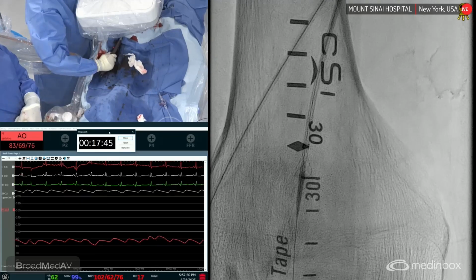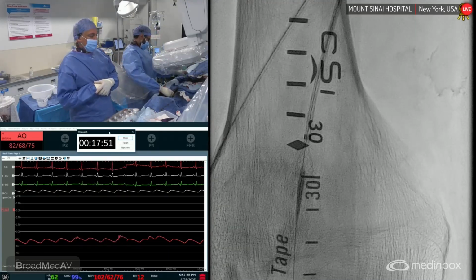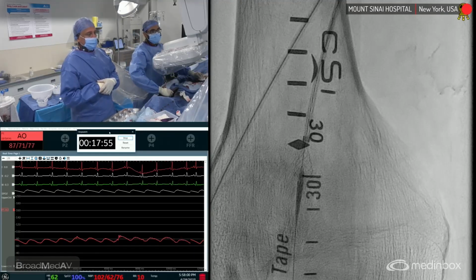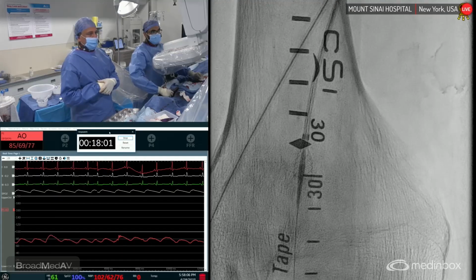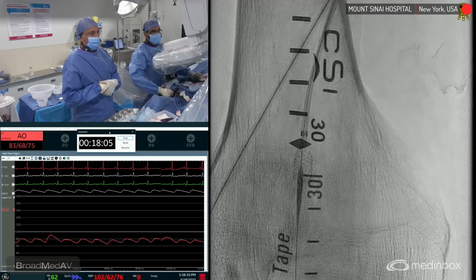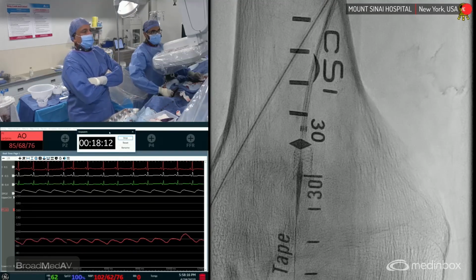Prevent the stent from expanding, from elongating. Although we know from our data that using DCB as vessel prep will reduce the restenosis if this stent does elongate. So I feel a little bit better knowing that I've given everything I can. And that data was with Impact DCB. So we use the right DCB to go ahead and prevent any, hopefully TLR rates will not be.